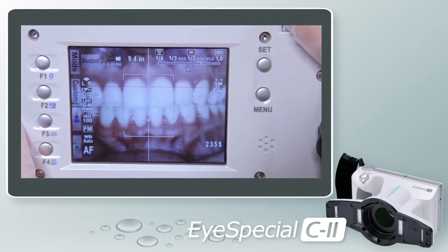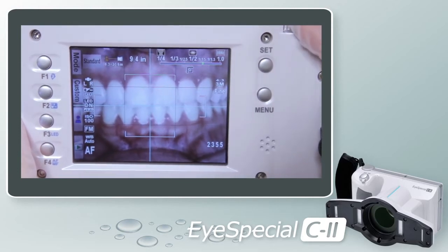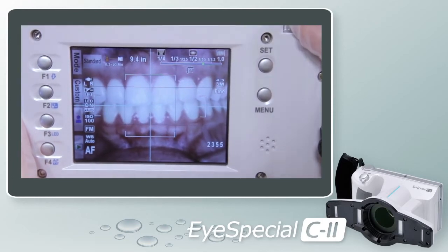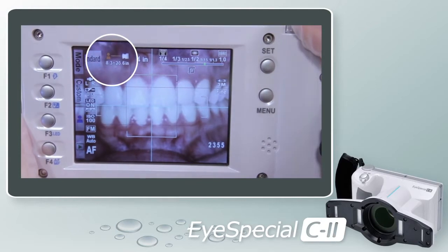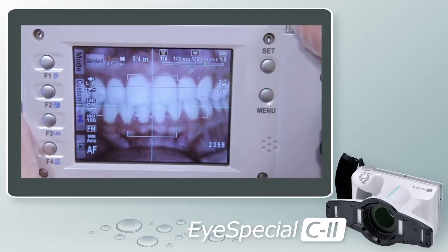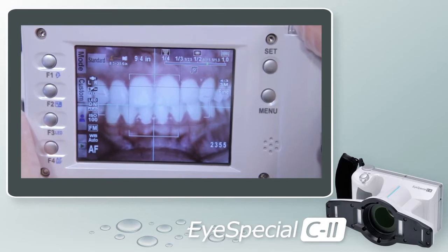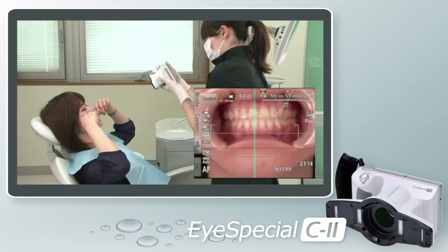The ideal distance for Standard Mode is 9.4 inches or 1 to 1.5. To the left of the number 9.4, you will see a small orange icon with a small camera. Below that, a distance range from 8.3 inches to 23.6 inches — the range in Standard Mode in which you can still achieve an in-focus image. Once you have selected your range, you are ready to take your shot.